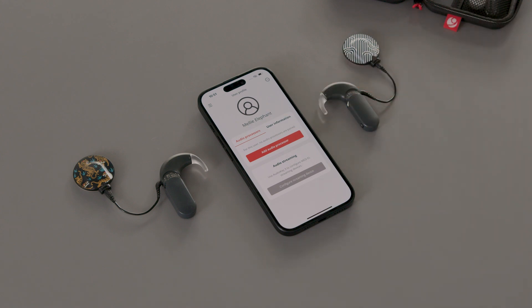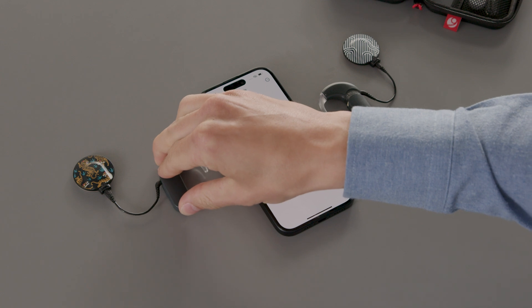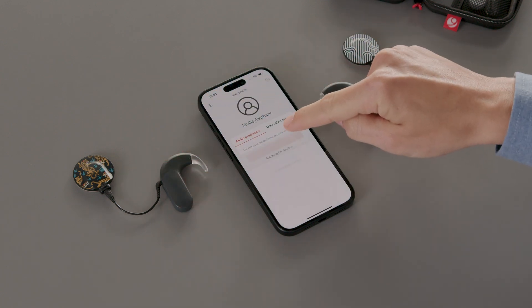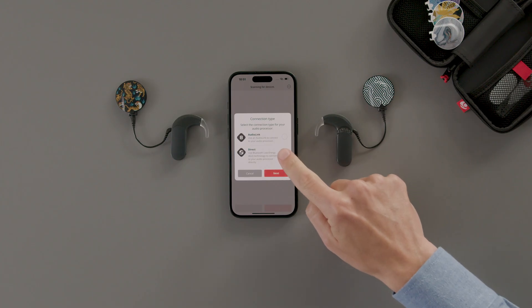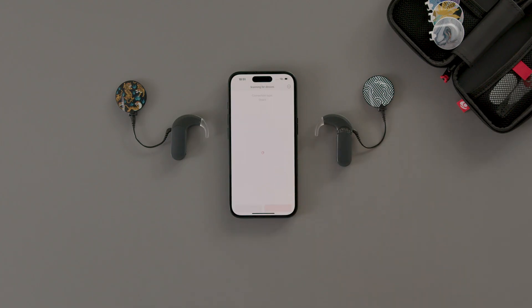Switch your audio processor back on. Tap Add Audio Processor, and the pairing screen will appear. Select the connection type for your audio processor, then tap Next. Audio Key 3 will automatically pair with your device.